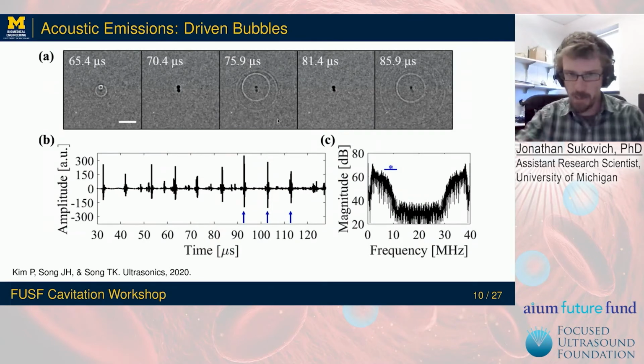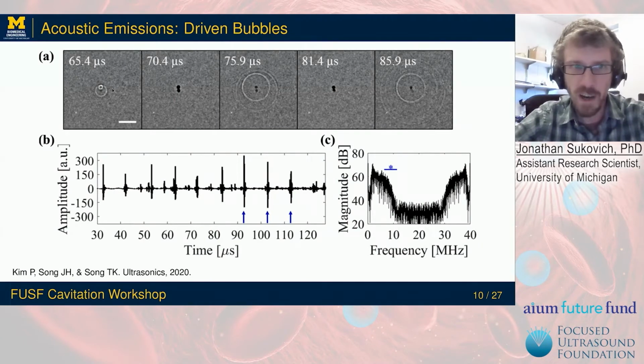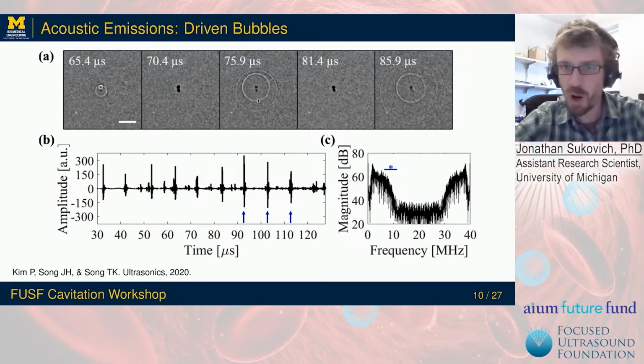And this is just an example of a bubble that's emitting these shockwave signals, broadband emissions, and emissions at subharmonics of the frequency that it was being driven at.